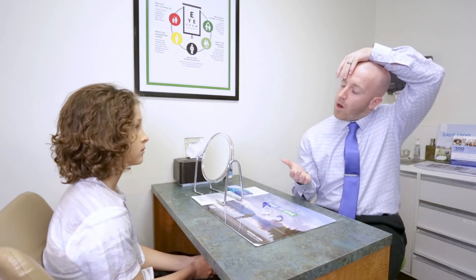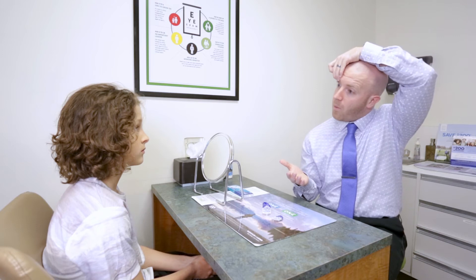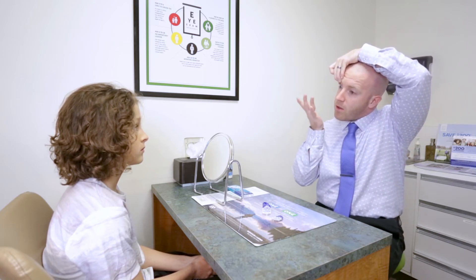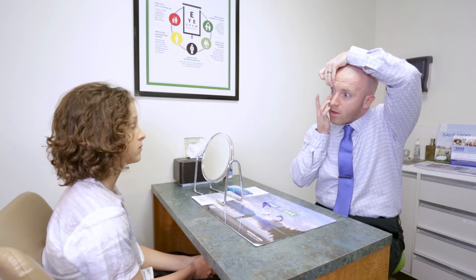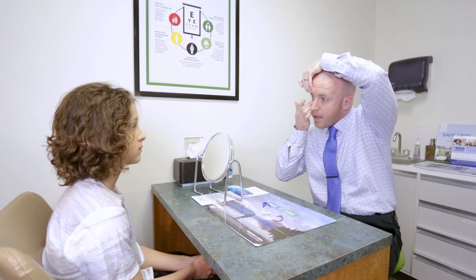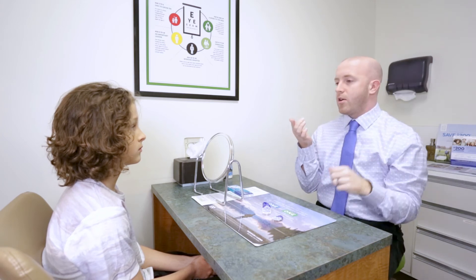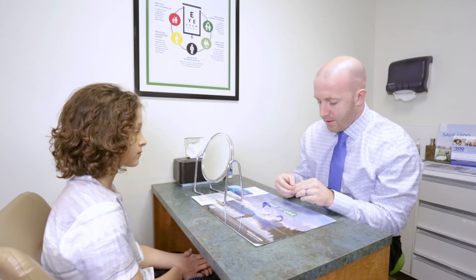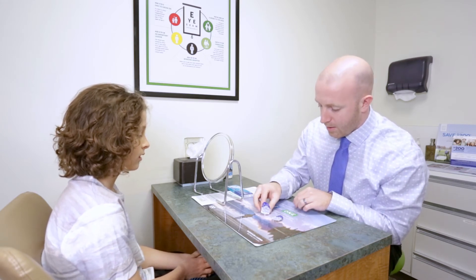What you'll do is take your opposite hand and go over the top and pull your top lid way out of the way. Then with this hand, use your middle finger or forefinger to get that lower lid way out of the way. Then look right in the mirror at the contact and put it right in the center of your eye. It'll take some time to get used to, but that's pretty much the gist of it.